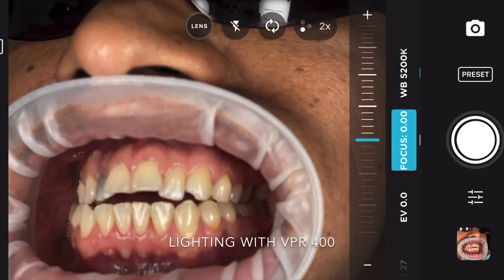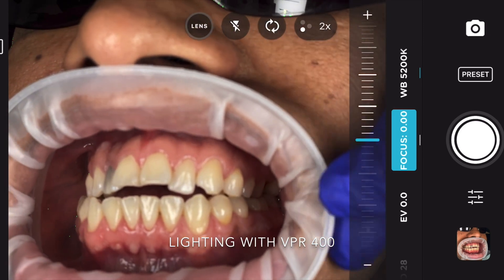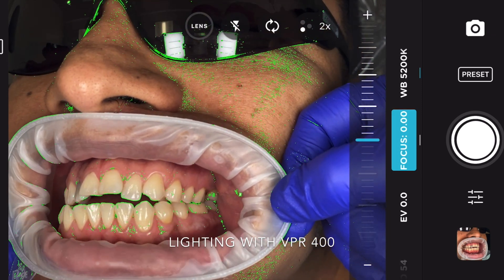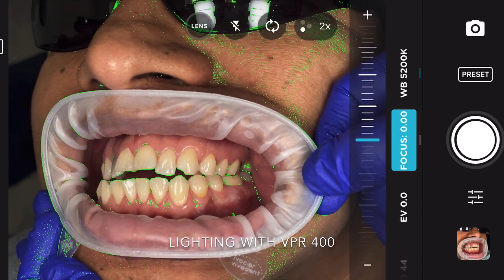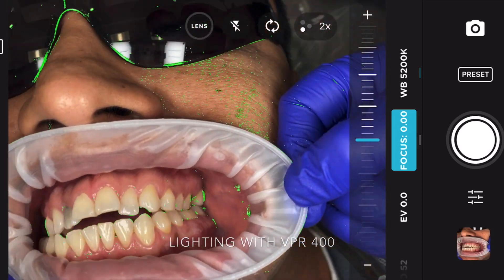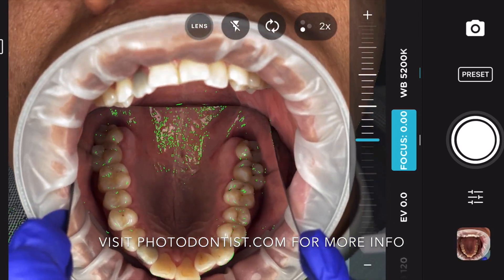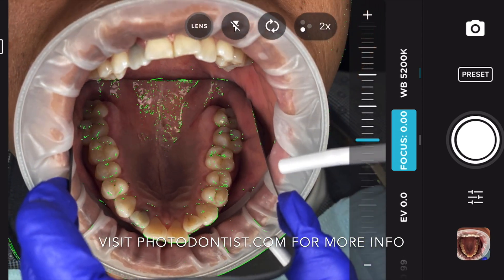You'll notice as I move in and out, the edges of the teeth highlight neon green. That means that is in focus, and you can snap your picture. As we put the mirror down, we can go ahead and move in and out, and as soon as we see green on those cusp tips or in the cusp grooves even better, we are in sharp focus and are free to snap a picture.